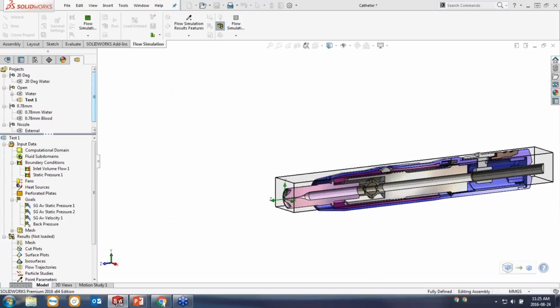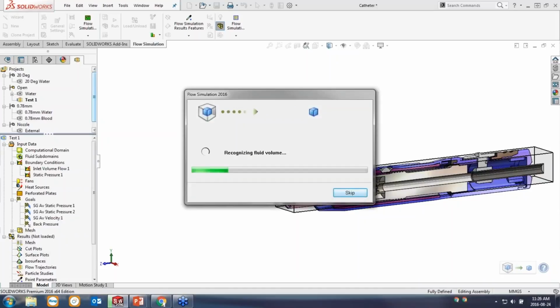I'm going to hit run, and this is going to open up a new solve window for us. And this particular analysis is going to run pretty fast, but I'm going to stop it along the process because I want to show you guys some of the things that you can do while it's solving.